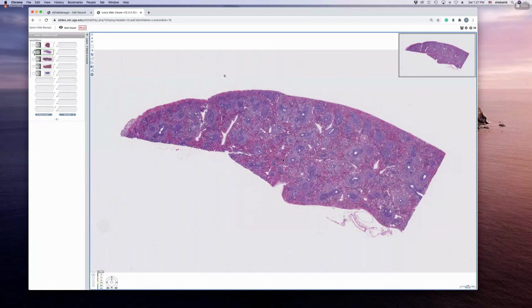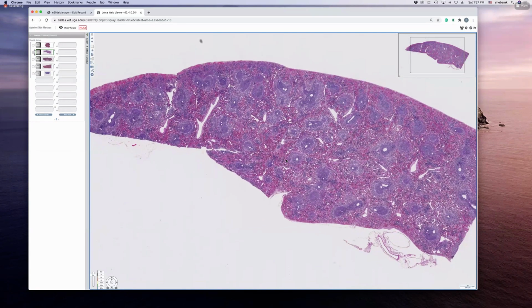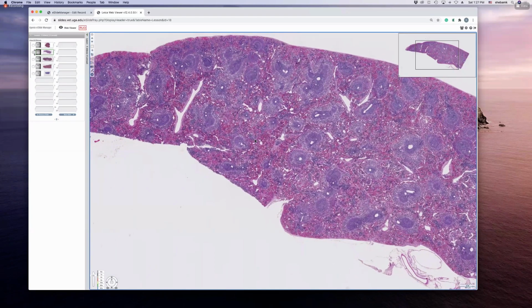So here the stromal cells would be the reticular cells, that provide the structural framework for these lymphocytes, which form part of the parenchyma, lymphocytes and macrophages. So they form the parenchyma here.